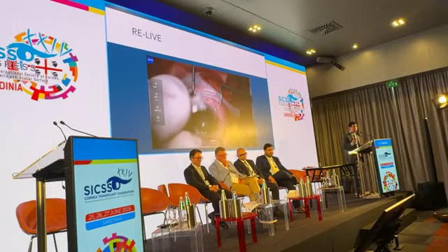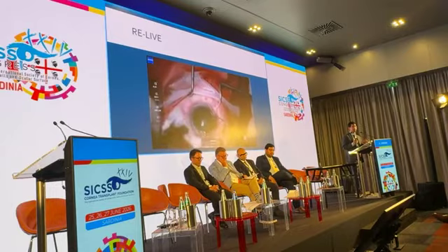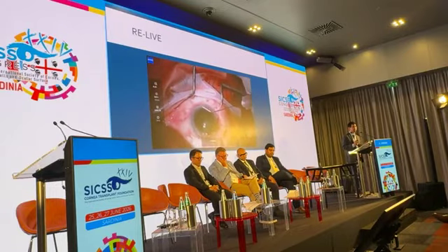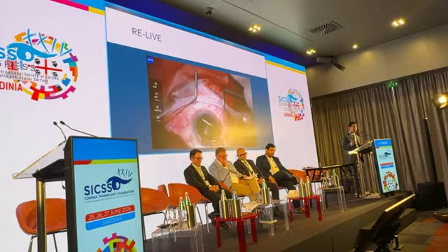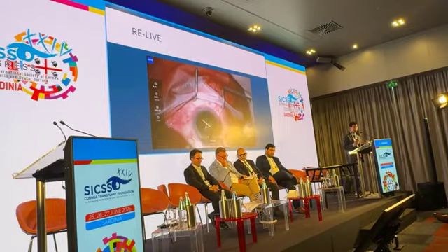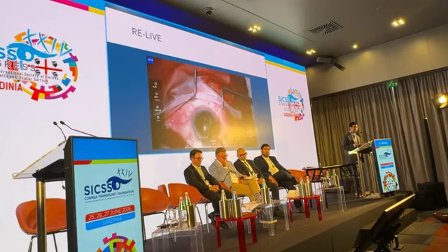You want to be within your epithelial edges and have a little space. Usually we recommend punching at least 0.5 under the measured area of where you measure with your calipers. That way, if the epithelium is not close to the edge of your graft, there's less chance of having epithelial ingrowth. So once this is moved into place, then it's really just smoothing out the wrinkles.